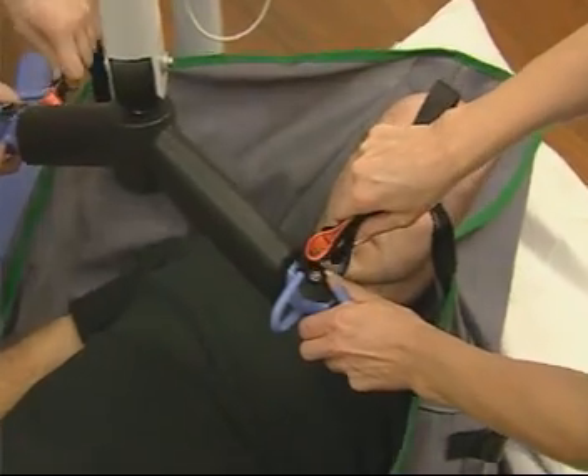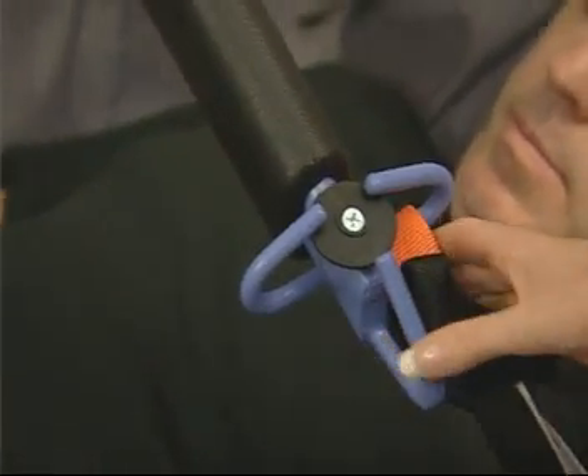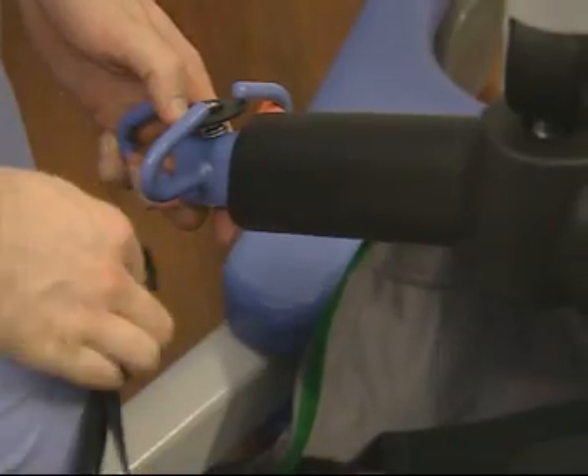The straps are then placed onto the hooks of the cradle. For a good sitting position, the shortest loops are used at the shoulders and longer ones at the legs. It may be necessary to bend the knees up to attach the leg straps.